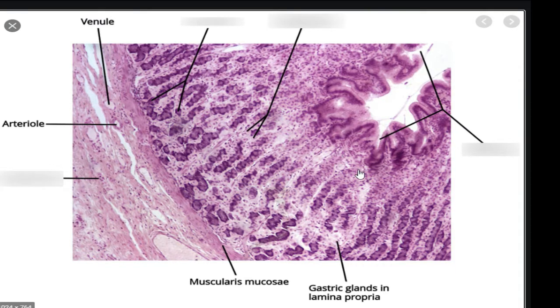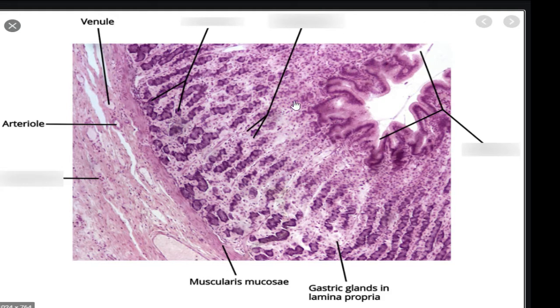Today we'll be discussing gastric adenocarcinoma. Before going into the slides, let us discuss the histology of the normal stomach. In the stomach you have the mucosa, which is lined by gastric glands. Below the mucosa, you have the muscularis mucosa, and then you have the submucosal layer.